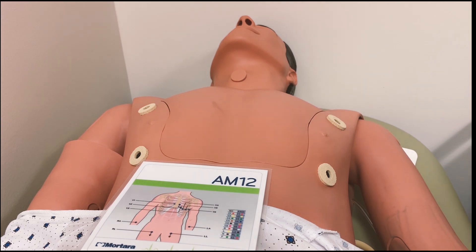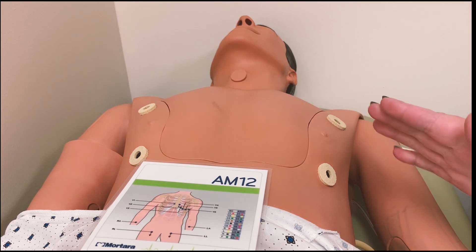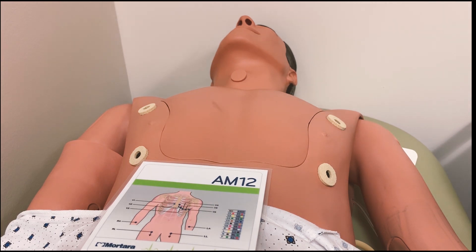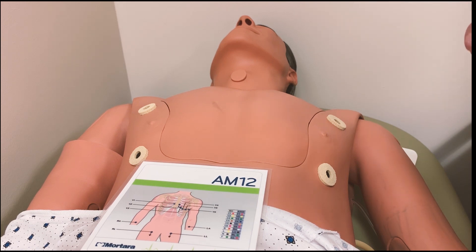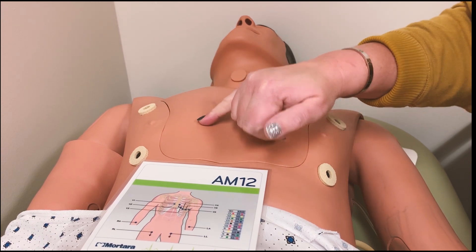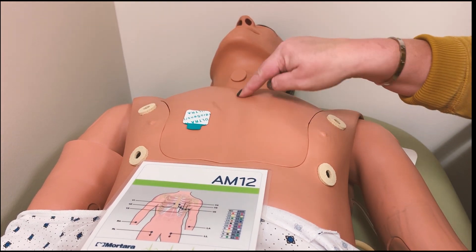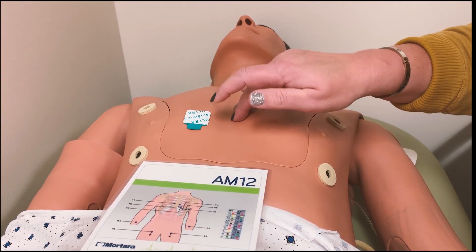For V1, you want to go on the right side of the sternum — this is the patient's right. Remember, when you are looking at a patient, they are always in anatomical position, which means if you are looking directly at them, your left and right sides are reversed. So the patient's right will be this side. V1 typically goes about mid-nipple line on the right side of the sternum. On a typical patient, you can actually feel the breastbone, which is the sternum.